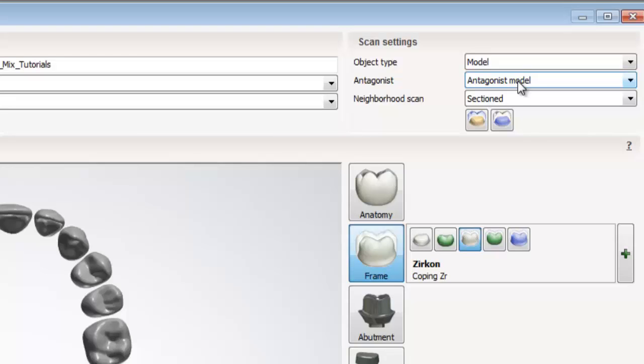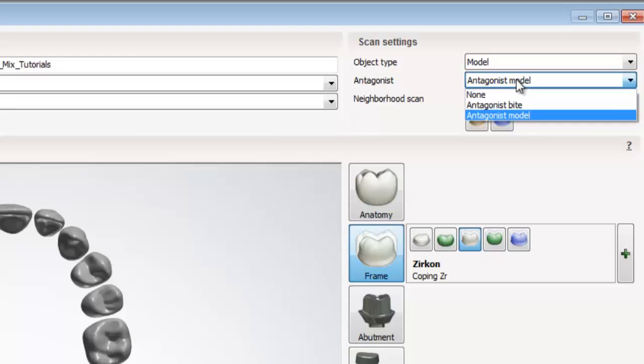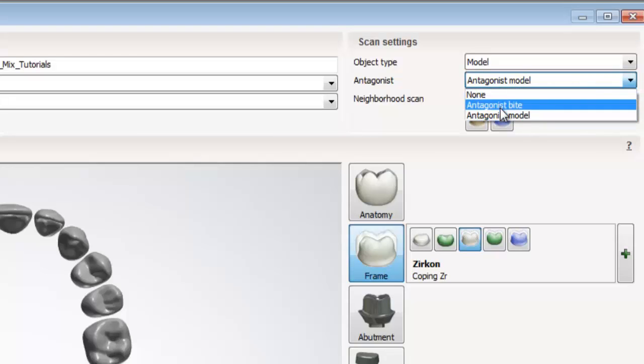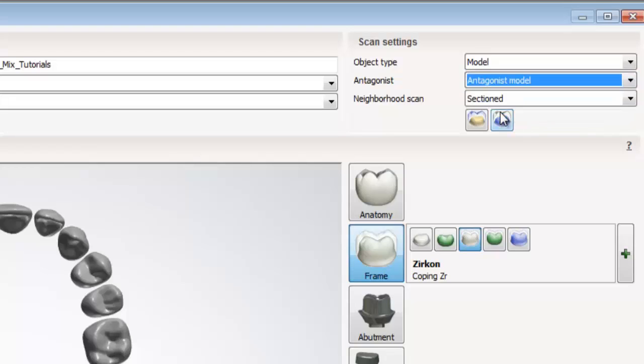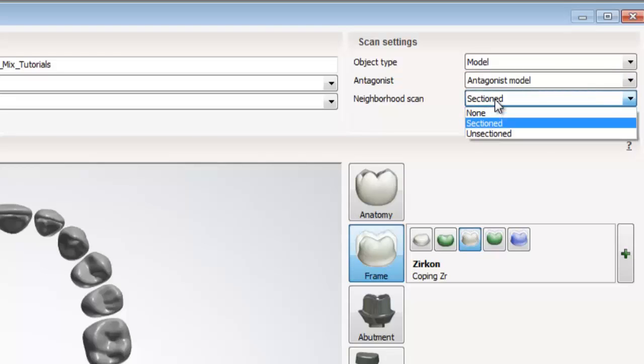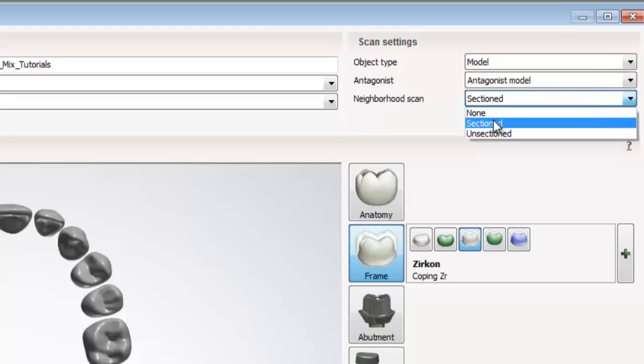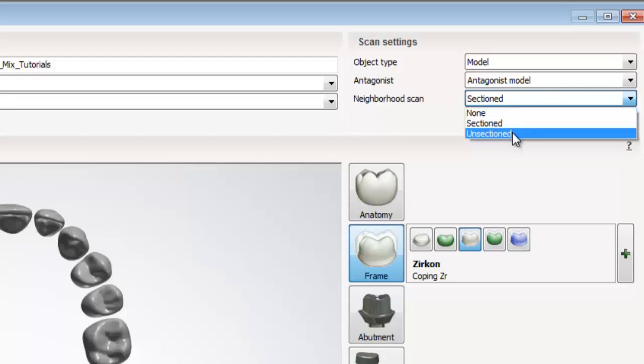Antagonist, it's asking us whether or not we have an opposing arch. And the neighborhood scan, it's asking us what kind of prep arch we have, whether it's unsectioned or sectioned.